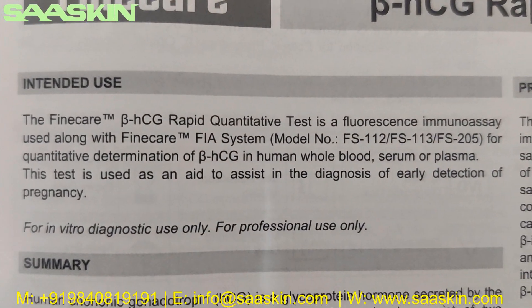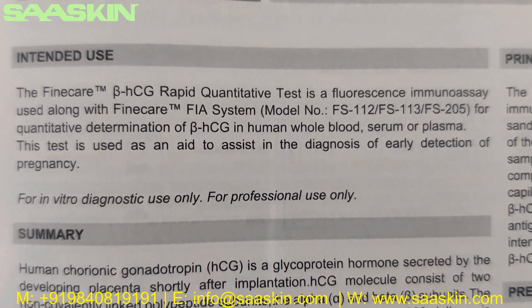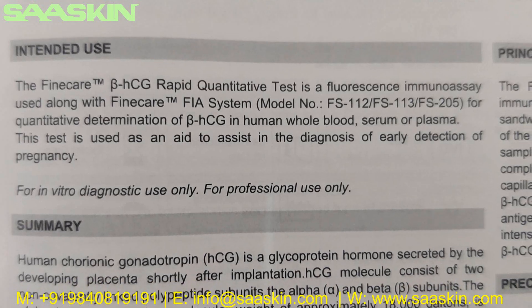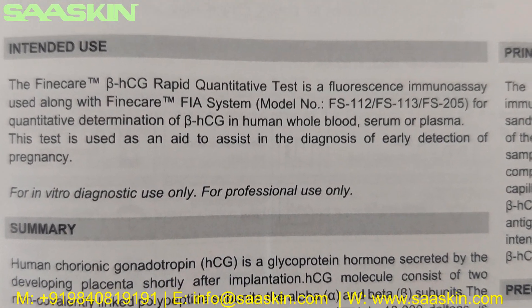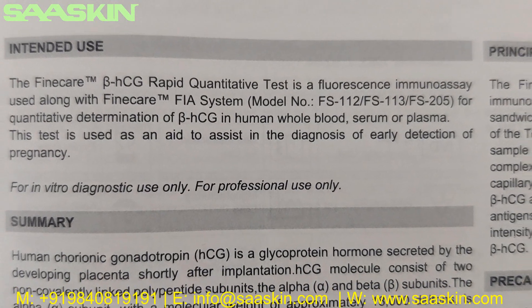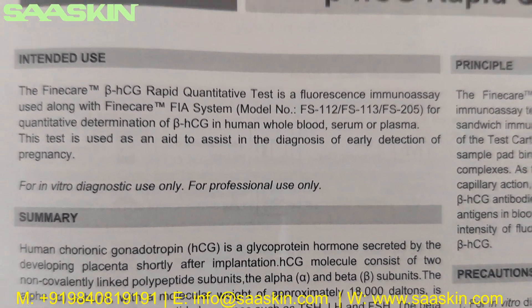Let's see the intended use here. The Fine Care Beta HCG Rapid Quantitative Test is a fluorescence immunoassay used along with the Fine Care system for the quantitative determination of beta HCG in human whole blood, serum, or plasma. This test is used as an aid to assist in the diagnosis of early detection of pregnancy.